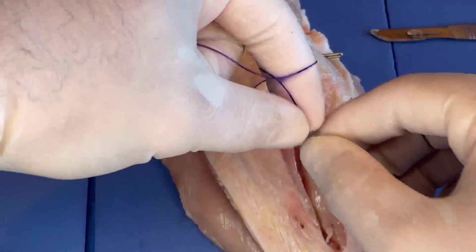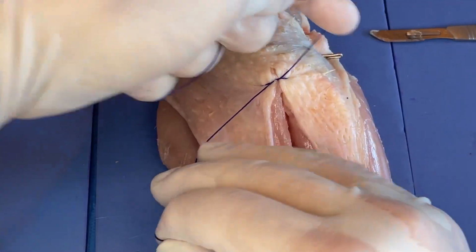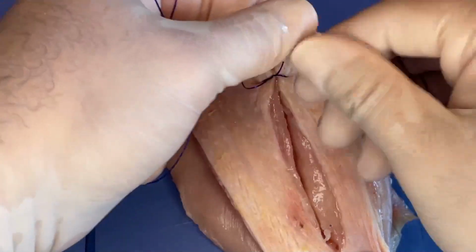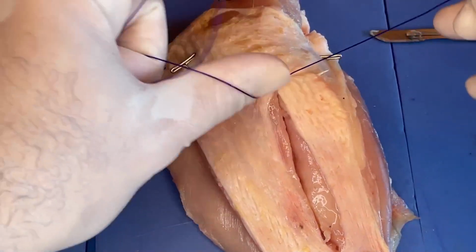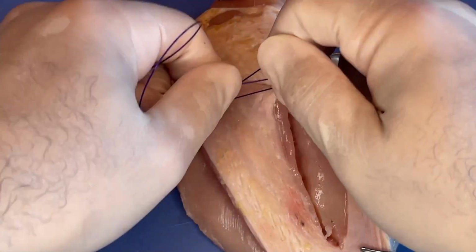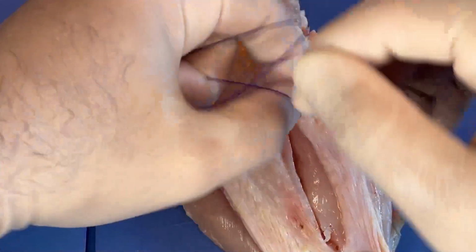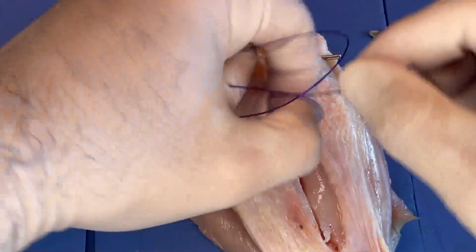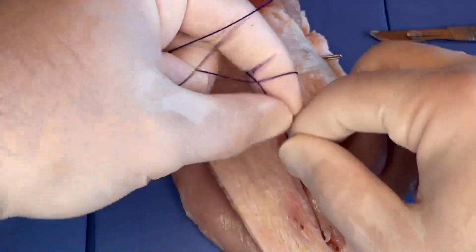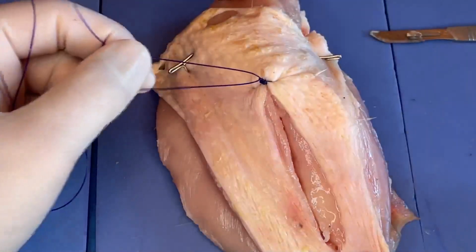And again, over the thumb and down, you can see how really clearly visible the suture is. Over the finger, and down, thumb, down, finger, down. So that's 4 throws. That's 2 square knots. We still need to do 2 more. So thumb and finger, that's 3 square knots. Thumb and finger, that's 4 square knots. So 8 throws, 4 square knots.